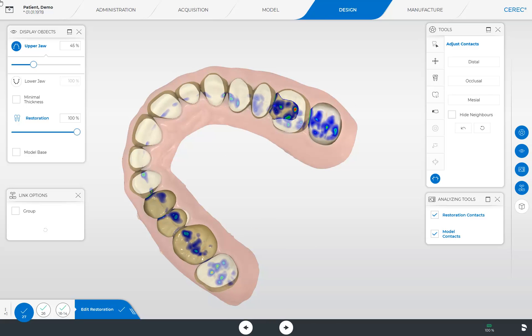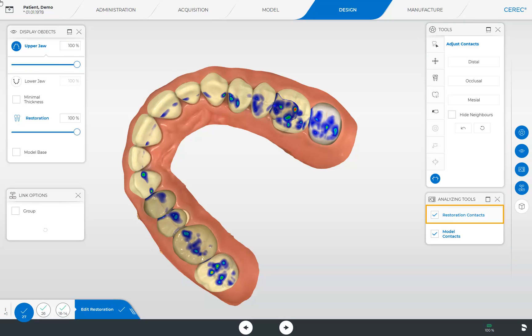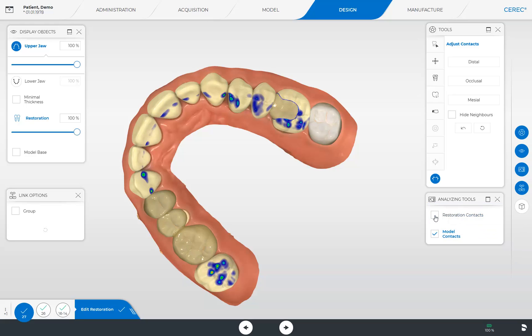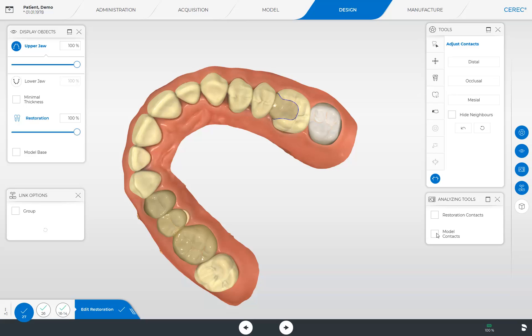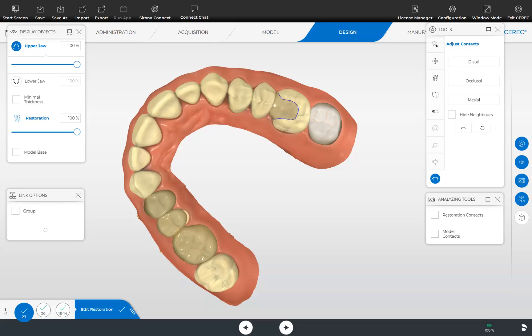Then we reset the visibility of the model to 100%, and for demonstration purposes, disable our restoration contacts and then our model contacts. Hiding the contacts makes it easier to assess the morphology of the restorations. Before we finish, we go to the functions in the system menu. We tap the icon at the upper left so that the system menu opens. In this phase, among other things, you can save or export your current case. You will find detailed information about export options in our video tutorial on the topic of Export Options with CEREC Software 5.